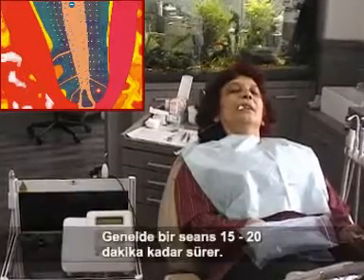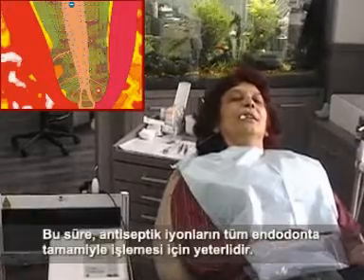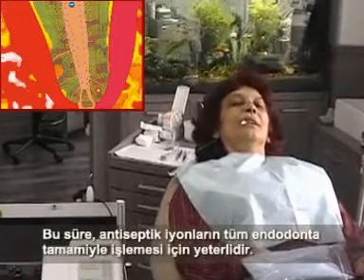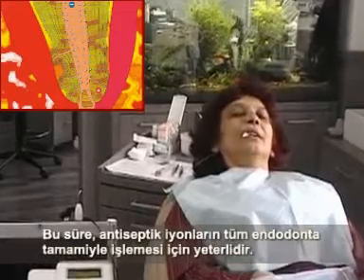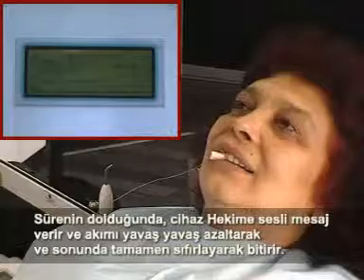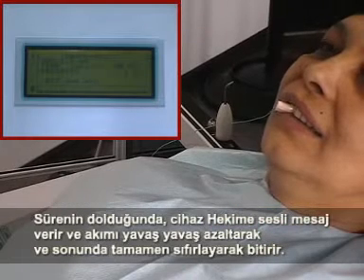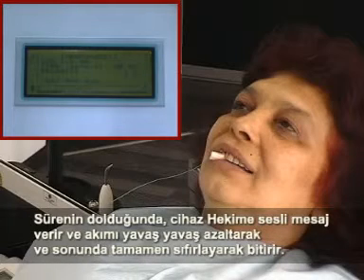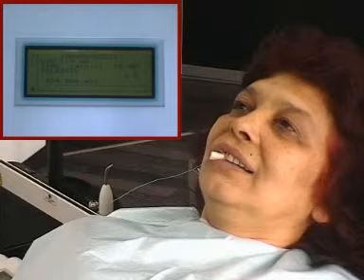Usually the procedure time is 15 up to 20 minutes, time enough for full infiltration of antiseptic ions in the whole endodontium. The device informs the dentist about time expiration and execution of the procedure, lightly decreases the current and finally switches off the patient from the current contour.